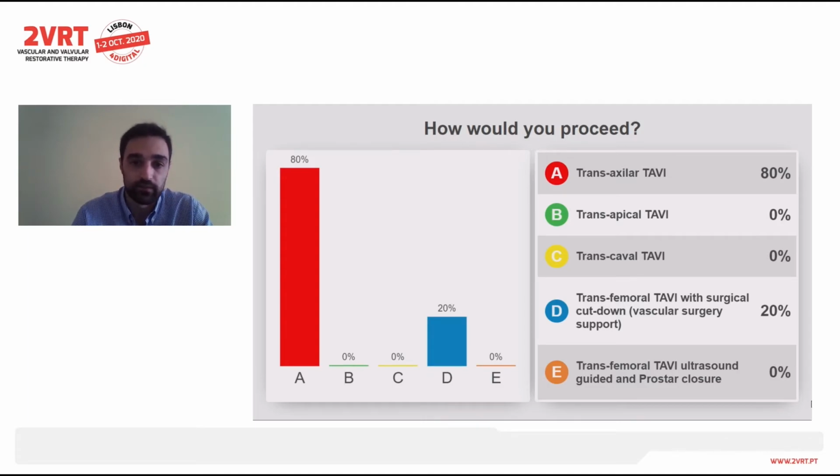Okay, transaxillary TAVI seems a nice alternative. By the time of the procedure, we didn't have so much experience in that alternative access site. But even though we must consider it, if it would be transaxillary, we wouldn't have a clinical case for this symposium on femoral arteries, and that is a good reason why we chose another alternative. We followed with a transfemoral TAVI.